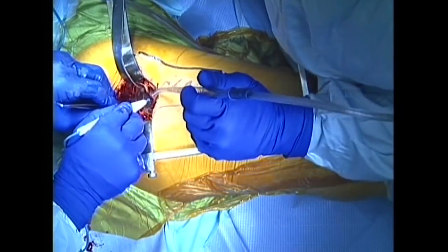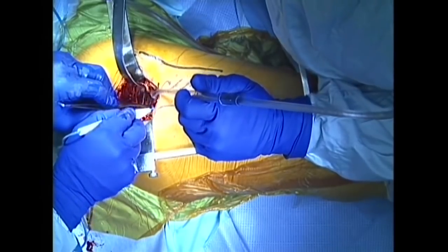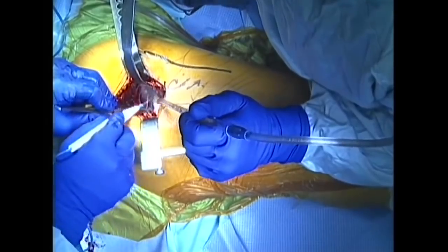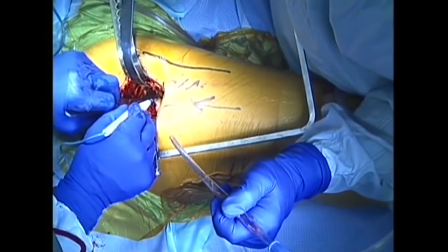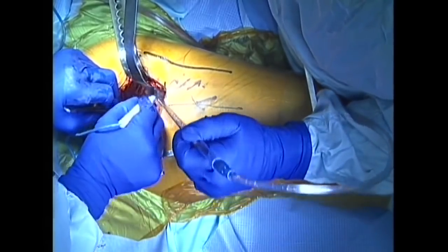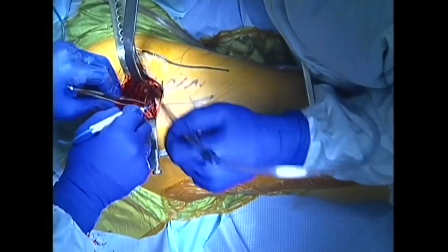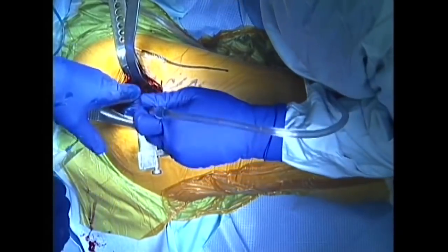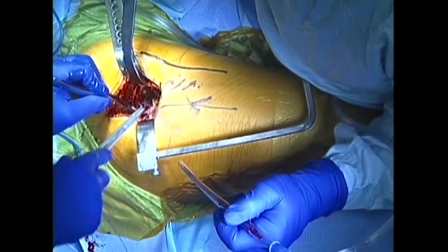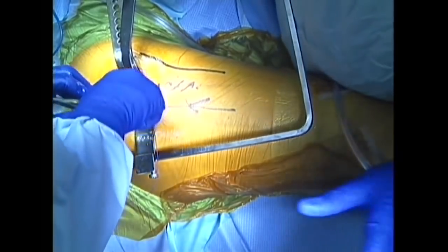Next, the joint capsule of the hip is incised and preserved, exposing the ball and socket of the hip joint. Stitches are placed in the capsule to help retract and preserve tissue.